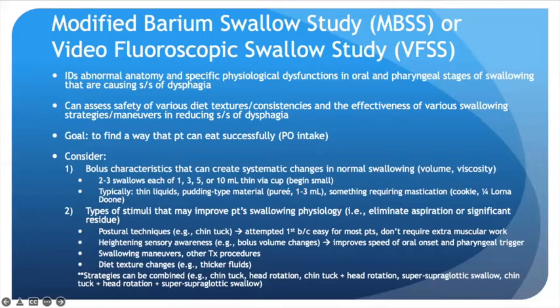You might examine the types of stimuli that might improve the patient's swallowing physiology. And the goal is to eliminate aspiration and significant residue.